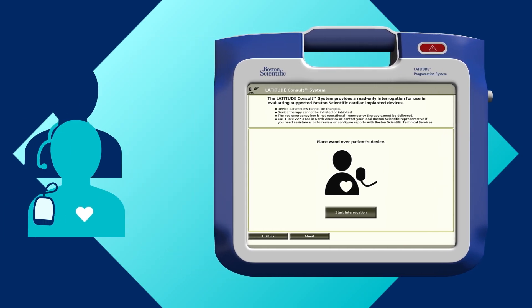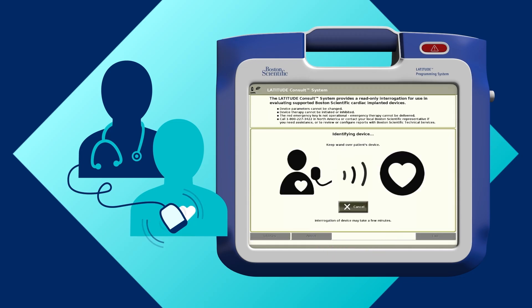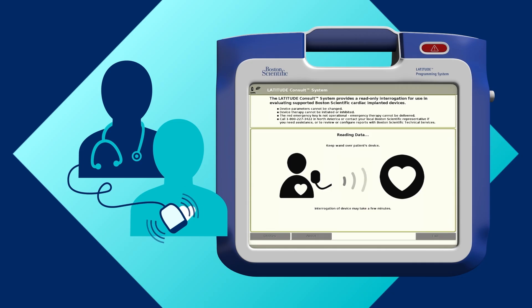Then place the telemetry wand over the patient's implanted device. Press the start interrogation button and follow the on-screen instructions to read and send data to the secure Latitude Consult server. A green light will blink on the wand indicating telemetry to the implanted device.